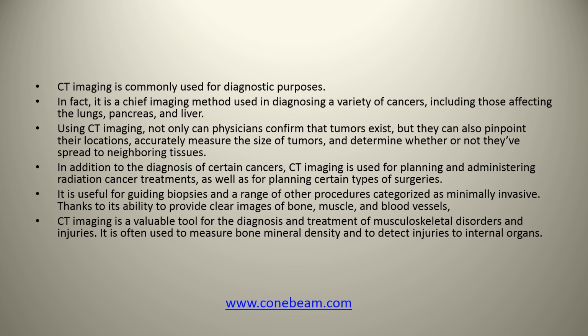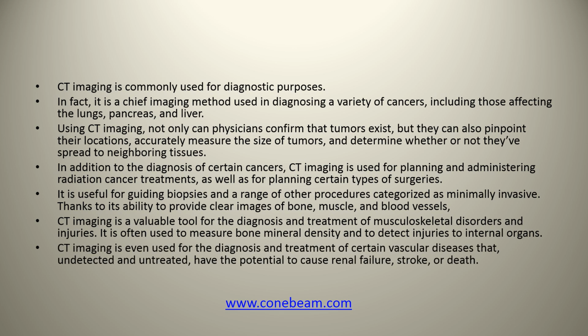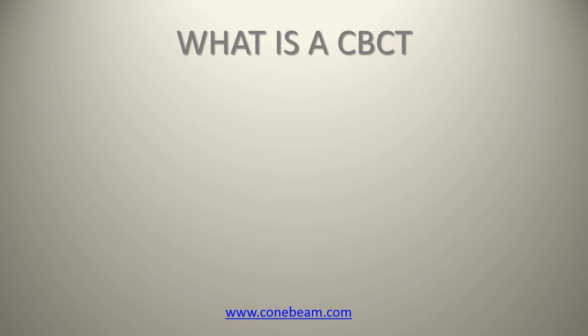It is often used to measure bone mineral density and to detect injuries to internal organs, and CT imaging is even used in the diagnosis and treatment of certain vascular diseases that, undetected and untreated, have the potential to cause renal failure, stroke, or death. So what is a cone beam CT?